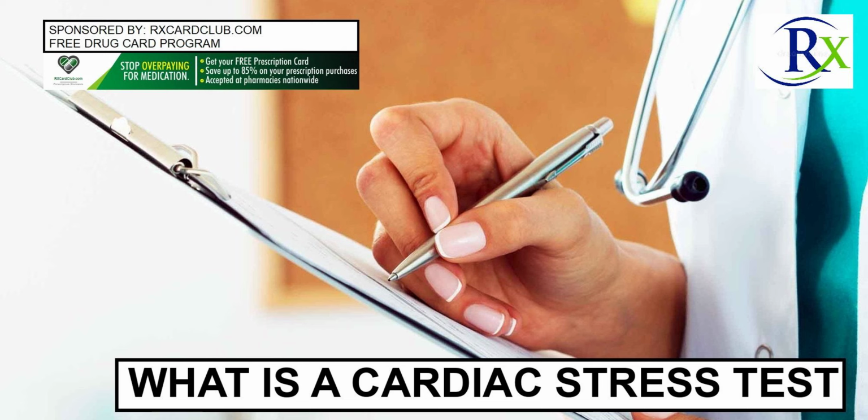Depending on the aims of the test, you may undergo what is called a maximal stress test or a submaximal stress test. By definition, you will be asked to stop the test at any time if you feel moderate to severe chest pain, severe shortness of breath, dizziness, or fatigue. Similarly, the test will be stopped prematurely if the ECG indicates arrhythmia or your blood pressure is abnormally high or low.